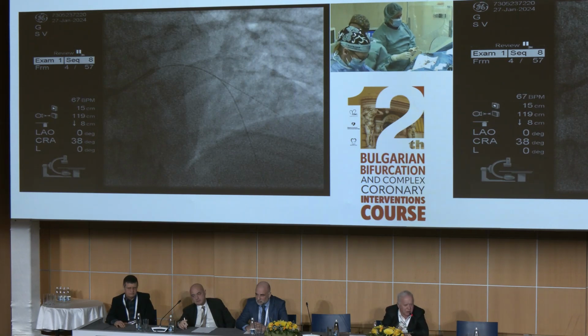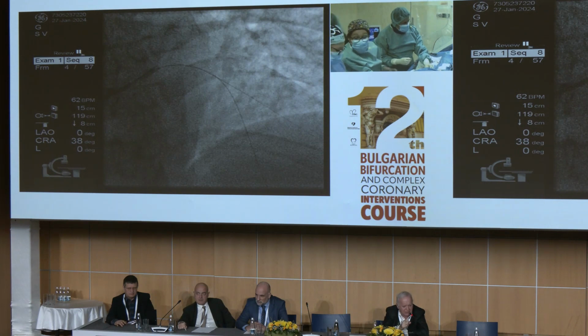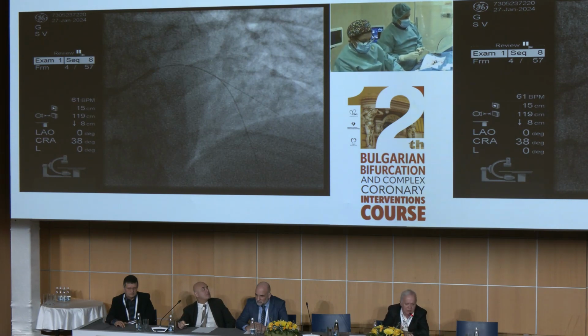And of course, my procedure will be crossover stenting, based on the distal diameters. If somewhere in the cath lab somebody is able to measure with a caliper the diameter in the normal part of the LAD distal to the bifurcation, and immediately at the ostium of the LAD, compared with a 6 French guiding catheter, it will be interesting for me.